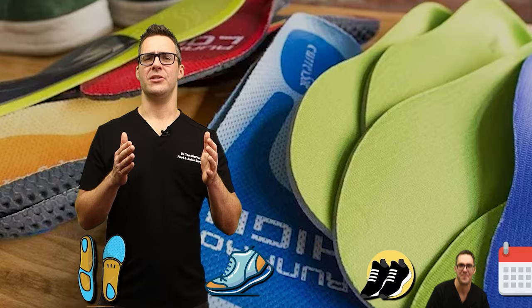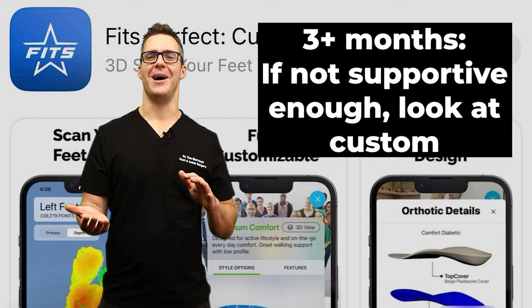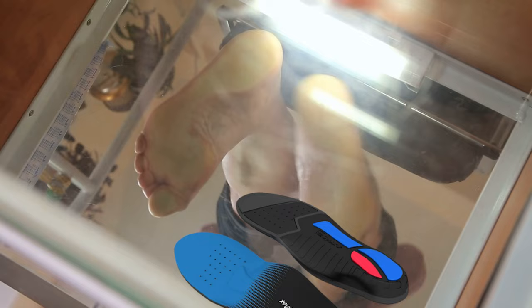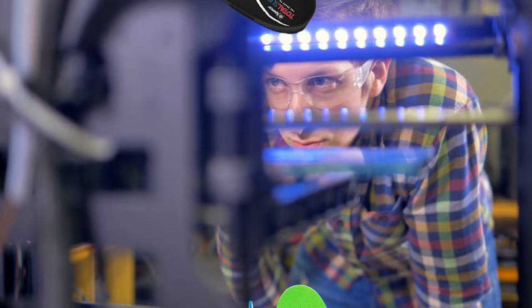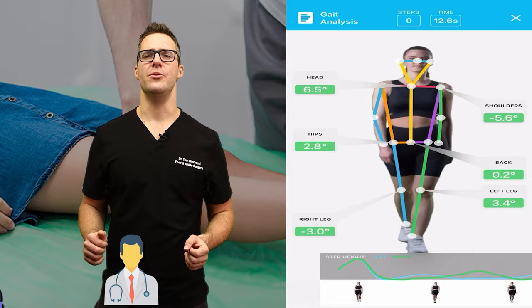For long, stubborn problems, custom inserts are the answer. Upstep works with a box you step in to create an impression, and Fits Perfect lets you use your iPhone to scan. If that's not working, you want to come see a podiatrist. If you're in Michigan, I would love to see you. I usually start with pre-made orthotics that I have available for free in my office, and then we have a 3D printer that can print custom orthotics at very cost-effective rates — often much cheaper than the pre-ordered ones online.